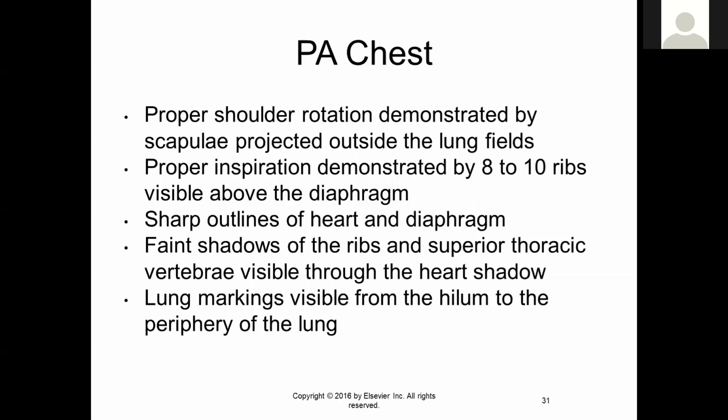Proper inspiration, demonstrated by 8 to 10 ribs visible above the diaphragm. So you will be counting ribs to evaluate your chest x-rays. We want to see 8 to 10 ribs visible above the diaphragm.